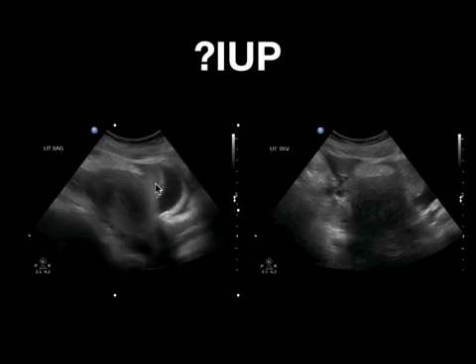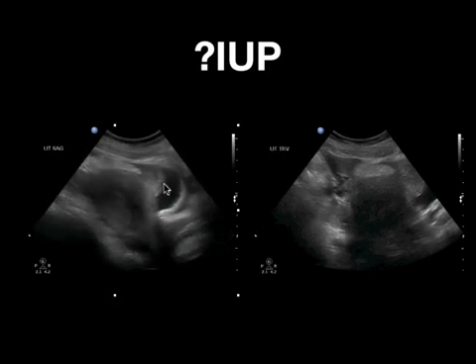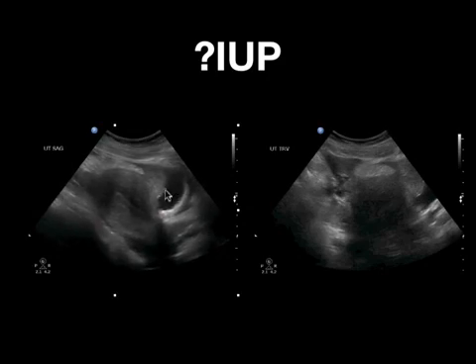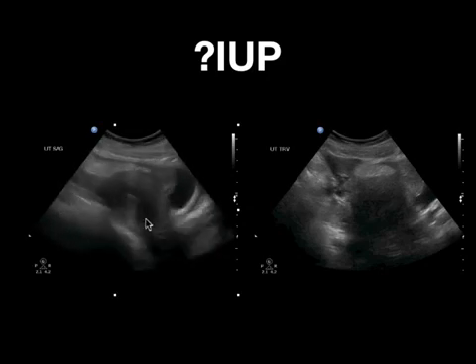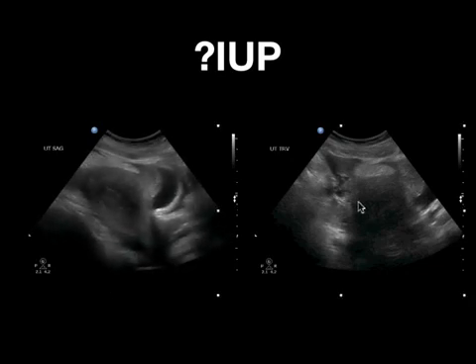You can also see this area right here that's kind of gelatinous in appearance. It's kind of shimmering a little bit. This is clotted blood. This is free fluid here in the anterior cul-de-sac. On this limited sweep in the sagittal plane, I don't see a definitive intrauterine pregnancy.